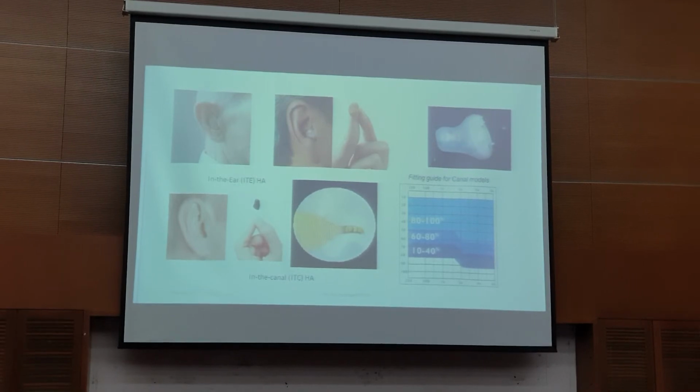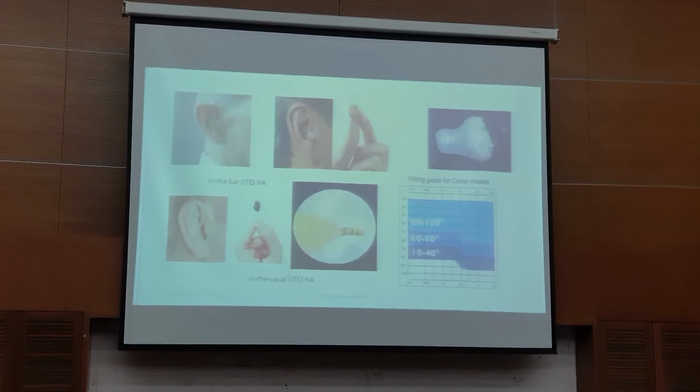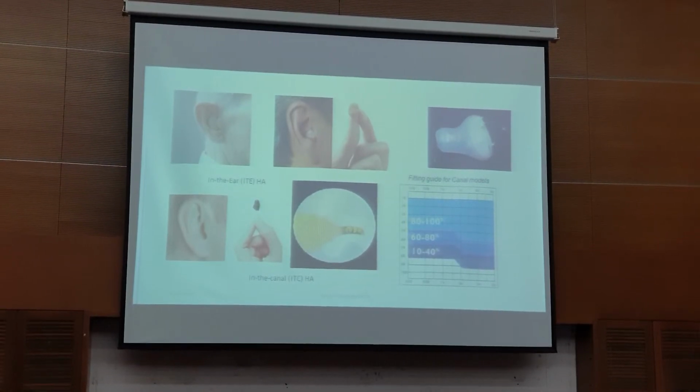So when we want to fit that hearing aid, we need to ask all those questions. Who are you staying with? Who is looking after you? Who is going to take care of these hearing aids? We don't want it left in the drawer, because they don't know how to check the hearing aid, whether the battery is still good or not, and so on. Alright. And then of course many people also like the in the canal hearing aid.